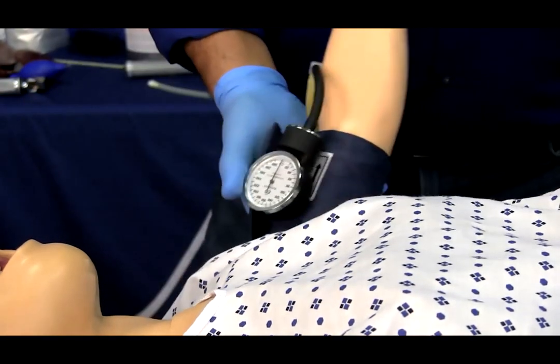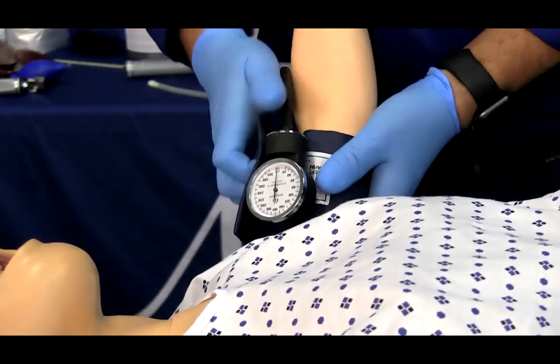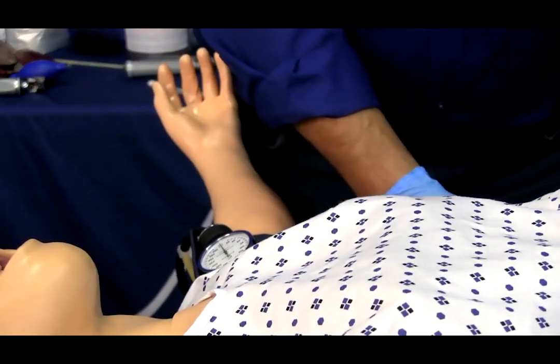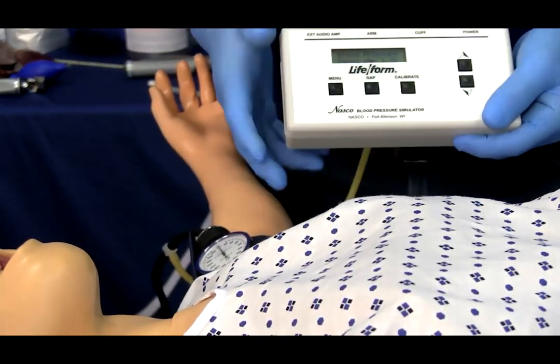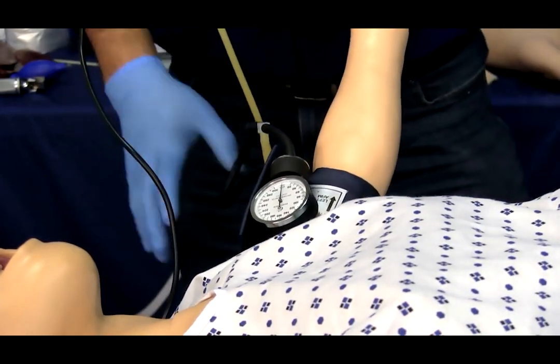To perform a blood pressure on Lucy, connect the arm, electronic control box, and blood pressure cuff following the instruction manual. Please note, we are using an external speaker for demonstration purposes. The speaker is not included.